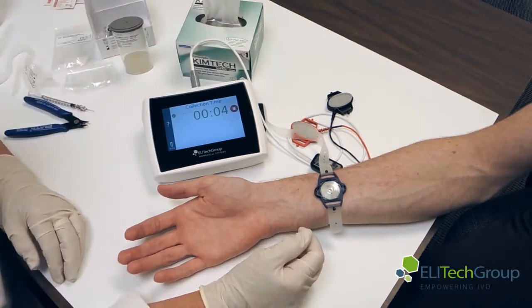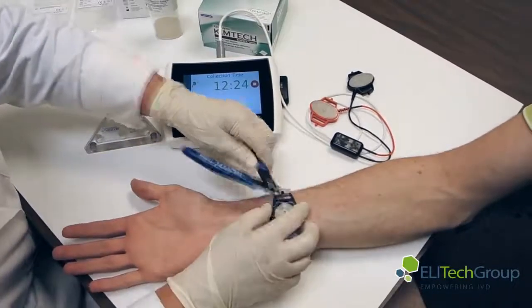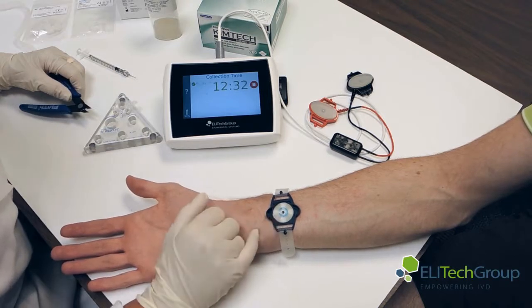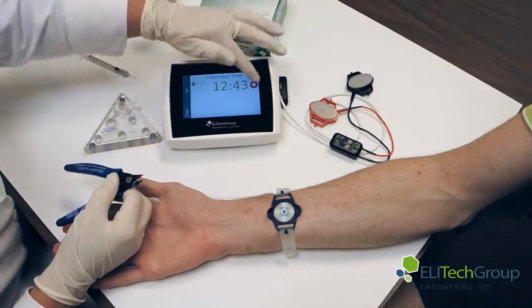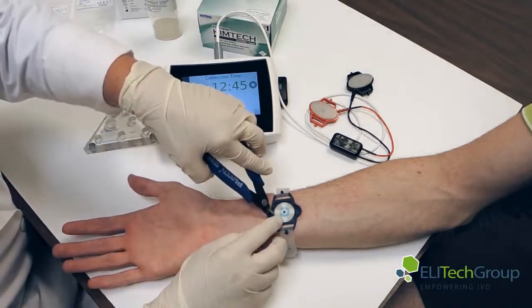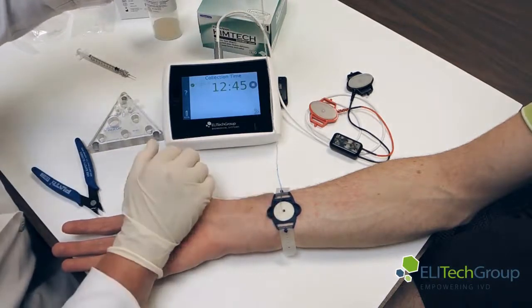The sweat collector device has a blue dot of dye on it. When the sweat comes up, it will be colored blue because of this dye. What we're looking for is that first sweat coming through — it may take up to one or two minutes. Once that sweat begins, we start timing for 30 minutes. We're now at 12 minutes. We pop the cover off so you can see the progression of the sweat. You can see it has progressed past two marks on the coils — the second mark indicates you have enough sweat to do the sweat analysis. We've collected enough sweat at 12 minutes and 45 seconds. We use the nippers to pull it up where the marks are located.